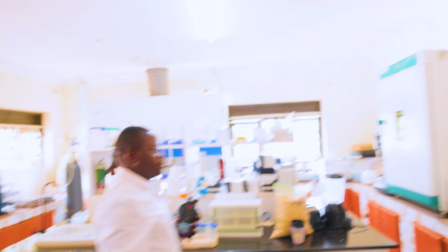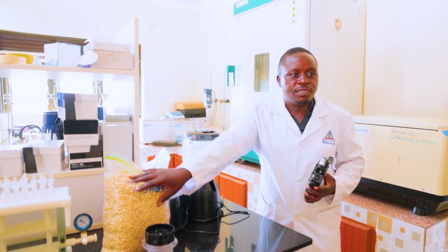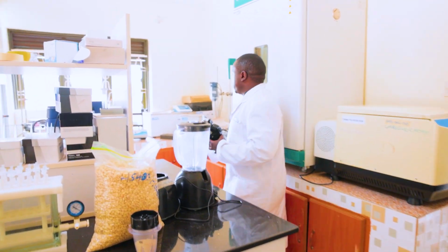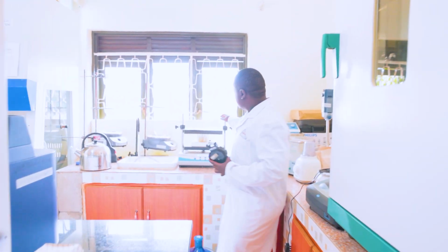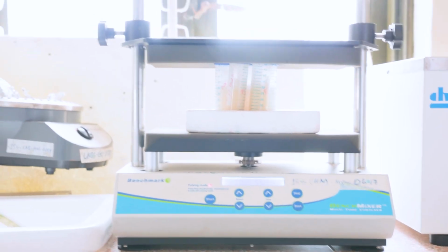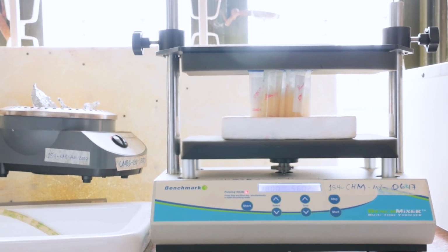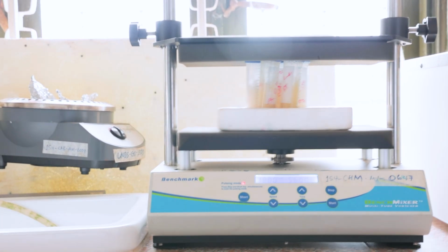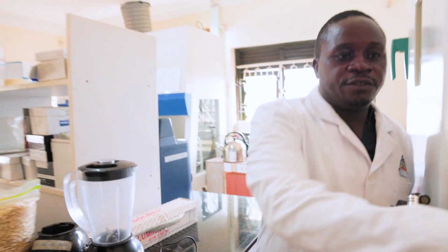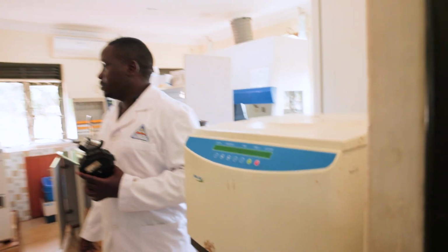And actually right now I'm extracting for aflatoxin analysis. We have maize grains and some other foods you'll see on the other side there. Currently I'm extracting this for aflatoxin analysis. We have different equipment, a centrifuge for that, whatever I'm going to use, the centrifuge and all that.